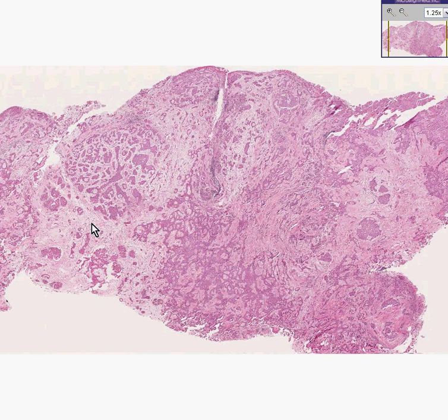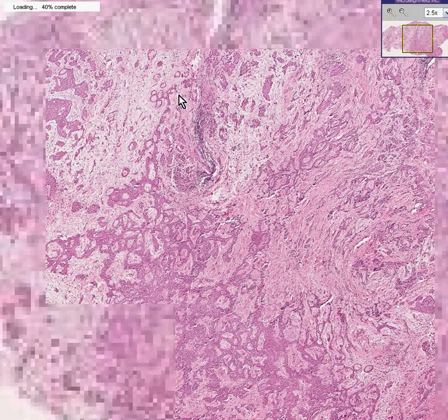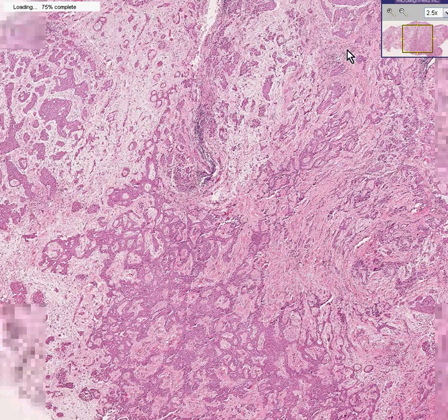Here is fibrous tissue, the whiter area. This whole thing is a pleural tumor. Here is a sort of infiltrating array, perhaps in a trabecular pattern, perhaps in a little cell ball pattern. Use whatever adjective you want because it doesn't matter as long as you're describing it honestly. And within this fibrous tissue you could see infiltrating nests of mesothelial cells.